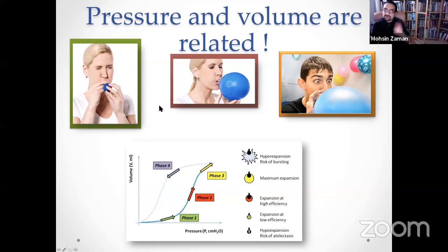And so what we do is we push air down the lungs. What that does is move the compliance of that lung. It kind of fills it halfway, so it doesn't really empty, and so it becomes easier to fill that lung up. Okay, and that's how we try to achieve this. Of course, making sure we don't put so much pressure that you end up in phase 3, the yellow bit, where you can actually burst the lung, because people have managed that.